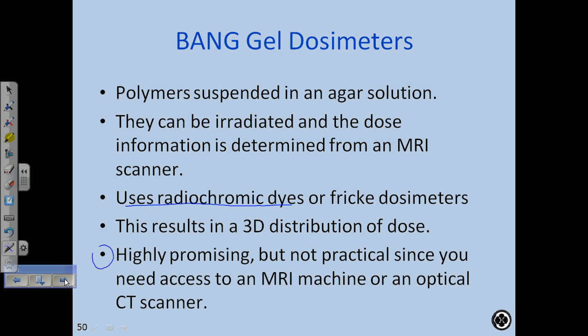But you need to know how to use this stuff. You need to be able to buy it, and you need to have an MRI. It's very hard to get time on an MRI because they're expensive and we're scanning patients on them.